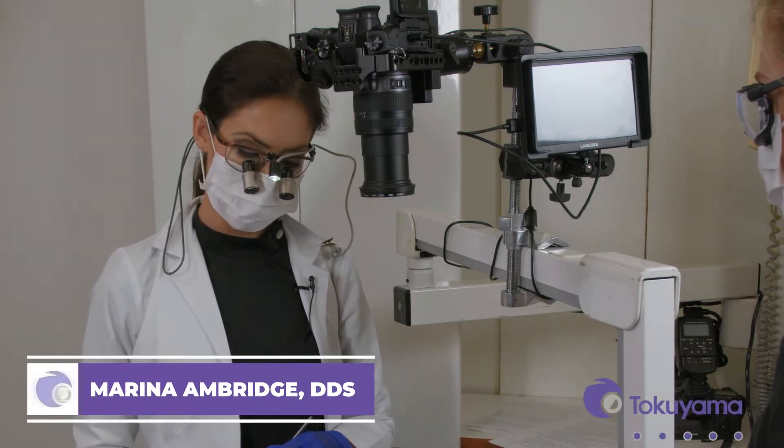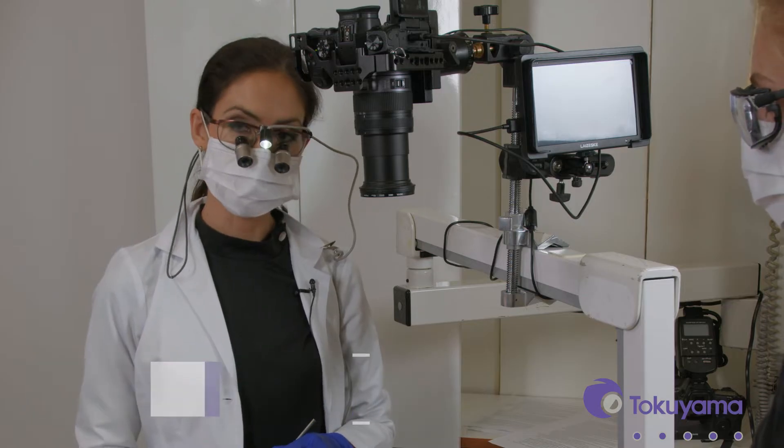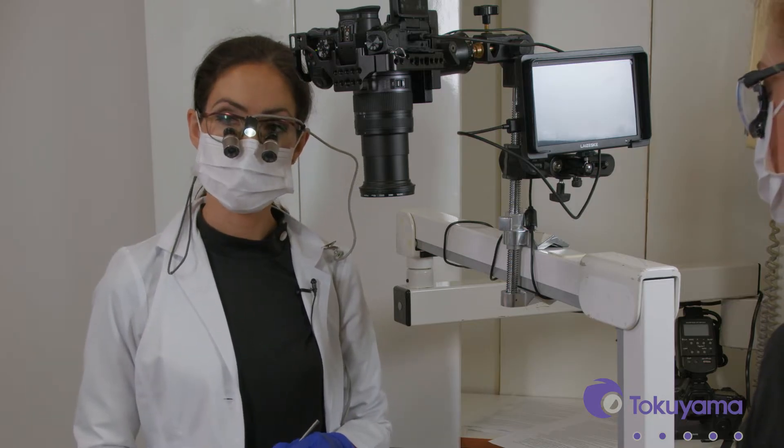We're going to start using the Omni Chroma product in a class 2 restoration on a premolar. So let's go ahead and get going.